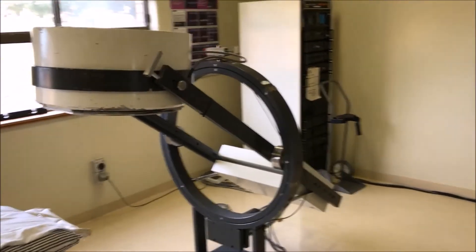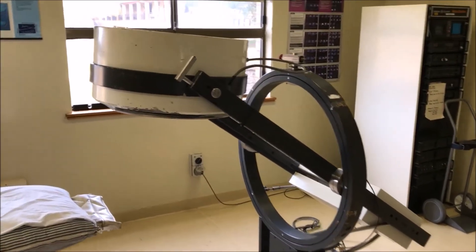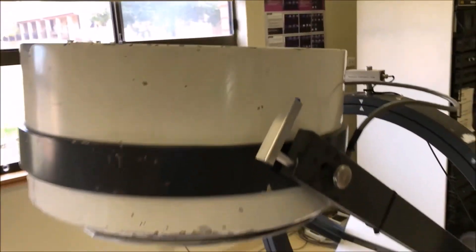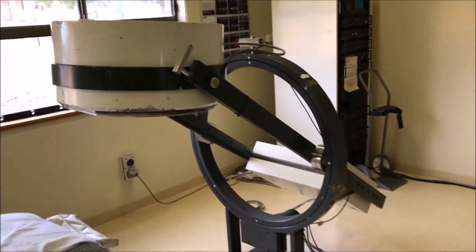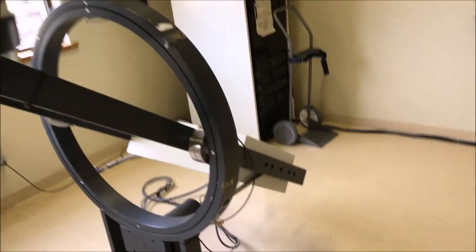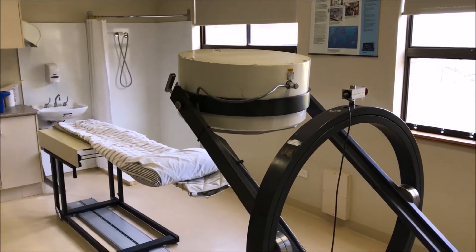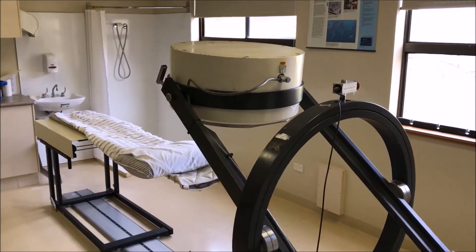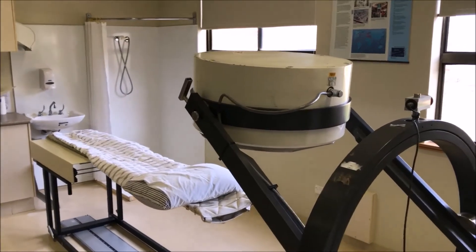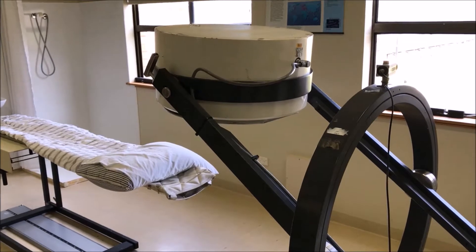The gamma camera sits out on an arm, and part of that creates a problem because you end up with decreased stability. If I give it a little bit of a push you'll actually see it rock back and forward. It does have a counterweight on the back, but nonetheless there is a degree of instability. These were fantastic for doing static images where we're imaging in one position at a time. These were also some of the first gamma cameras used for SPECT.